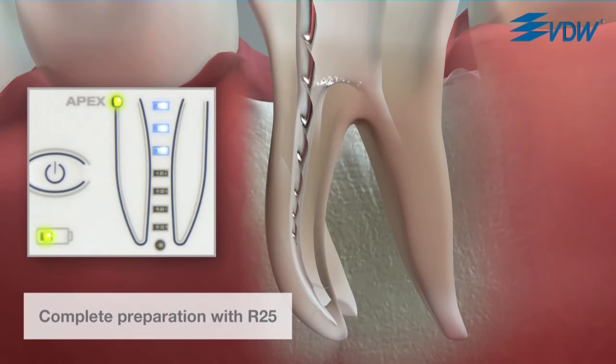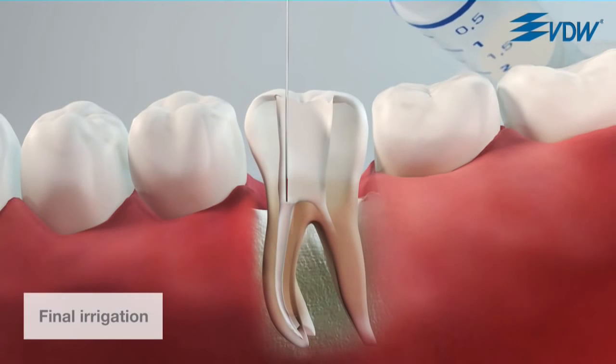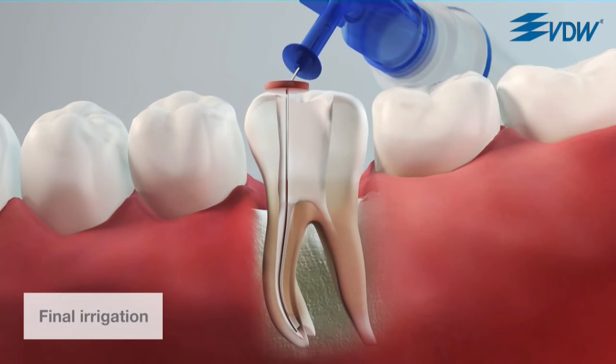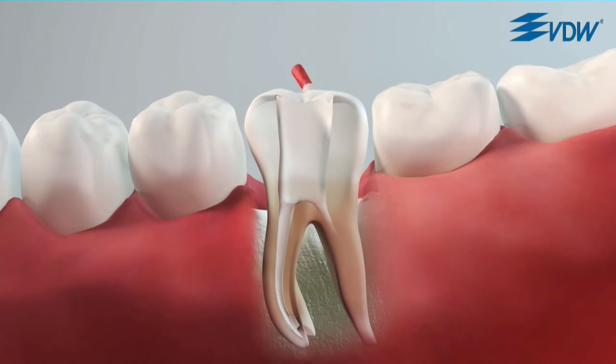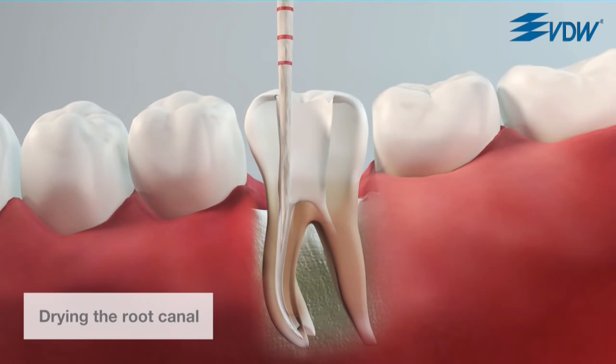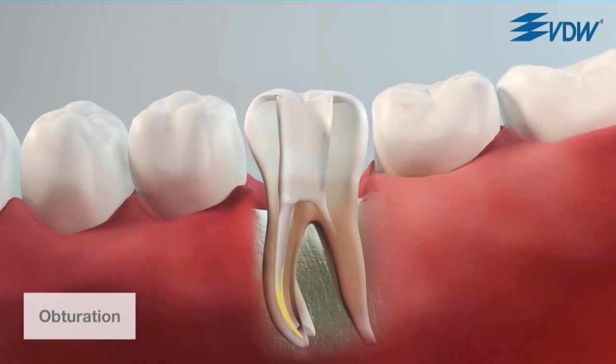During preparation of the apical third, you can use the motor's simultaneous length determination function. When preparation is complete, irrigate the canal and dry it with a Reciproc paper point. The root canal can then be filled. The shape of the root canal which has been achieved is optimal for obturation with both cold and warm techniques.